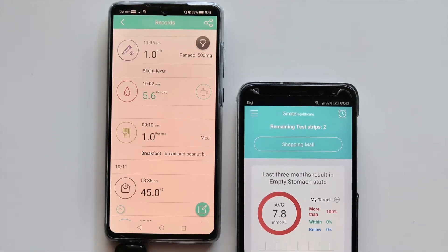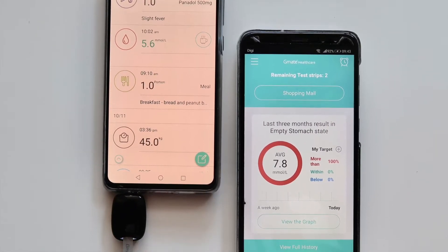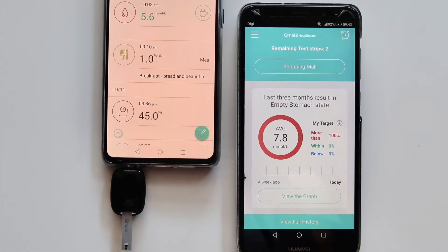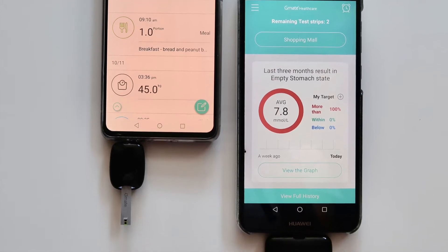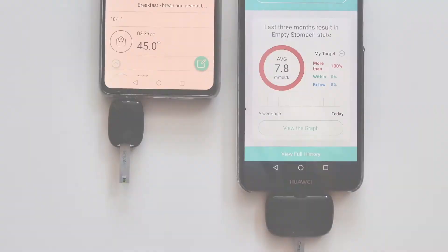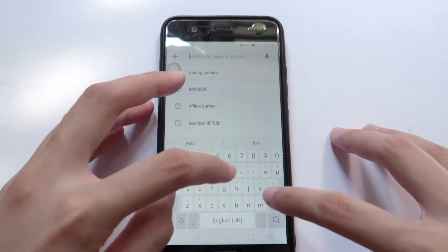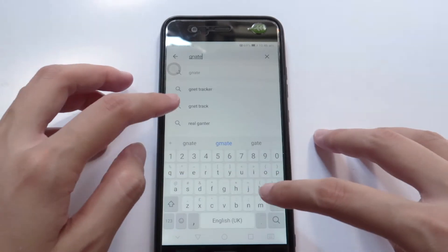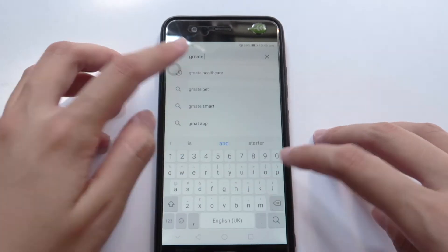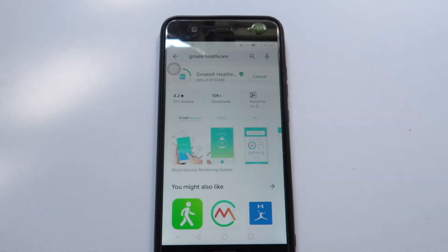Hi! Welcome to our first video of our Gmead Spot and On User Guide. Let's get started! First, go to Apple App Store or Google Play Store to download the Gmead Healthcare App.